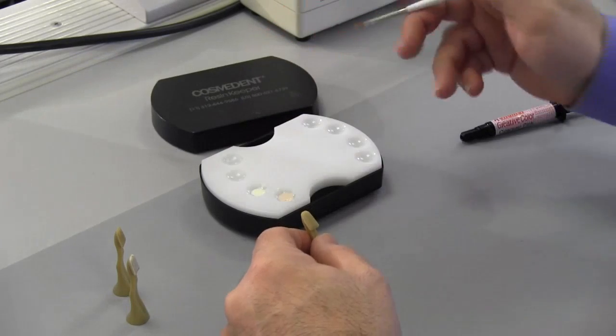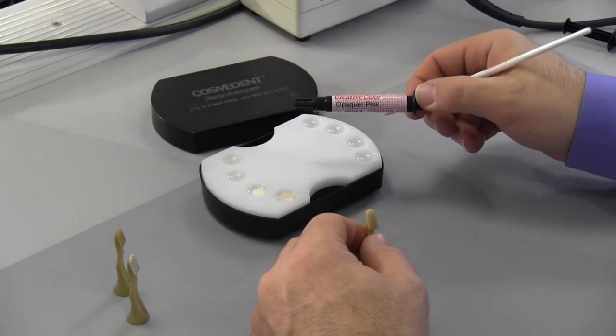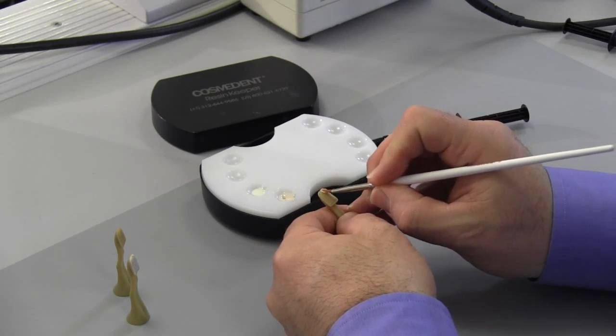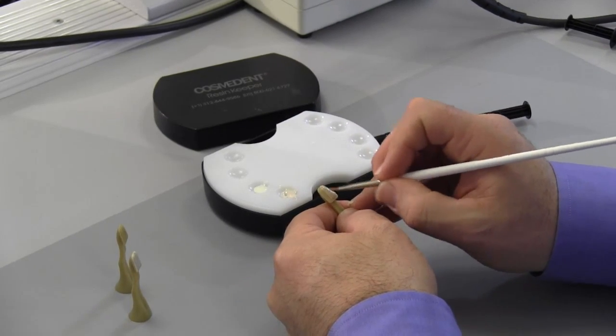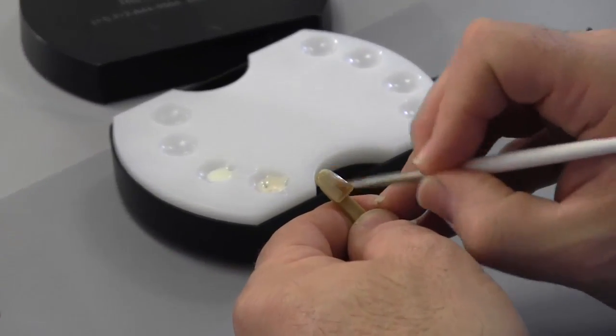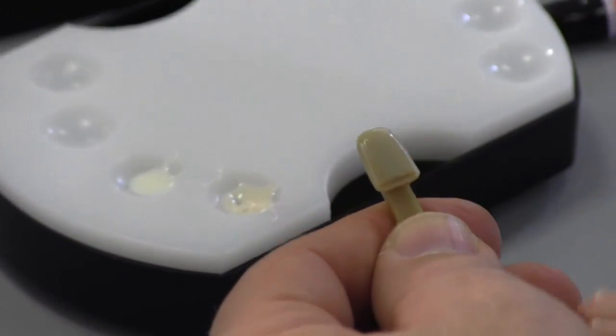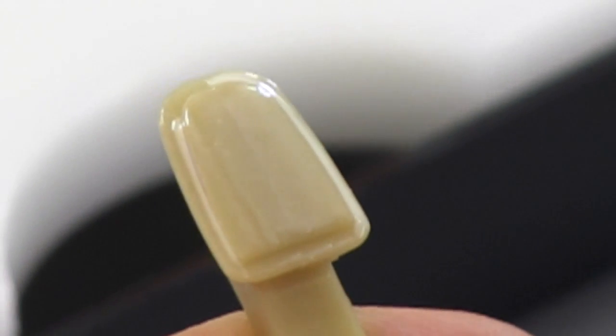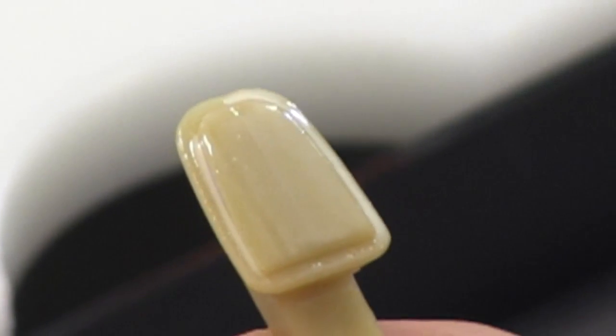Next we're going to apply the Creative Color Pink Opaque. You can see you want to put that on in a nice, even coat. Thinner the better to start. You can see this thin coat just lightly starts to change the color of that tooth without bringing the value up too much. It keeps it warm. Then we polymerize this for 10 seconds.